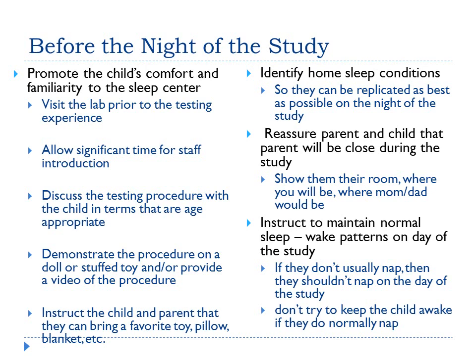Before your night of study for the pediatric test, there are some things you want to do to prepare. First of all, it's important that we promote the child's comfort and familiarity with the sleep center. So maybe they can set up a visit to the lab prior to their test night, allow time for the staff to introduce themselves, preferably have the tech there that's going to be performing the study, and let them discuss the testing procedure with the child in terms that the child is going to understand. Make a game out of it, make it play, make it fun. Maybe you're going to demonstrate parts of the procedure on a doll or a stuffed toy, or maybe provide a video with some animation of the procedure.